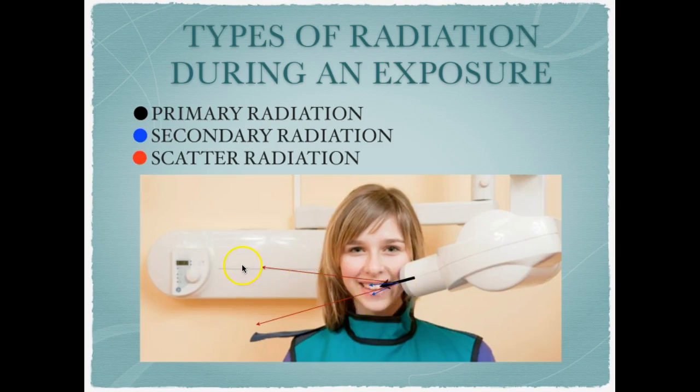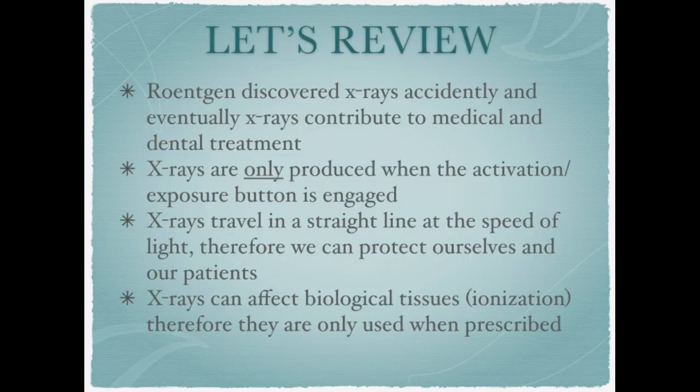It's all traveling in a straight line. So as long as you, the operator, are not in that path of the PID, the direction of the PID, you're going to be protected. We'll look at standards of protection in another slide presentation. But you do have to work smartly with dental radiation.